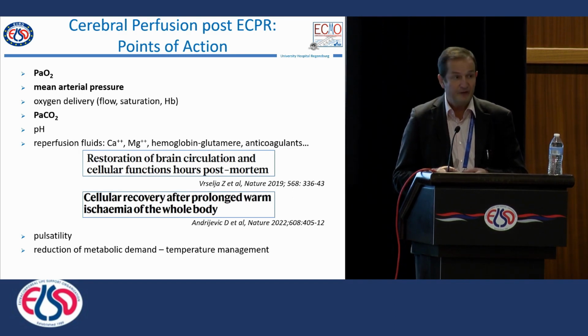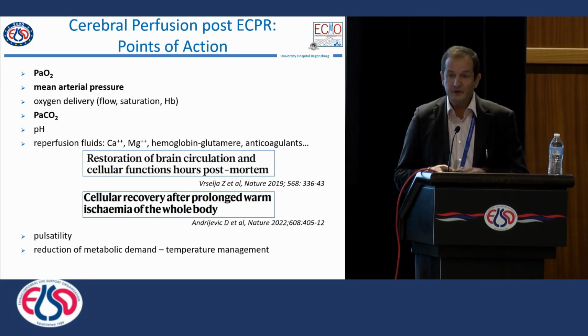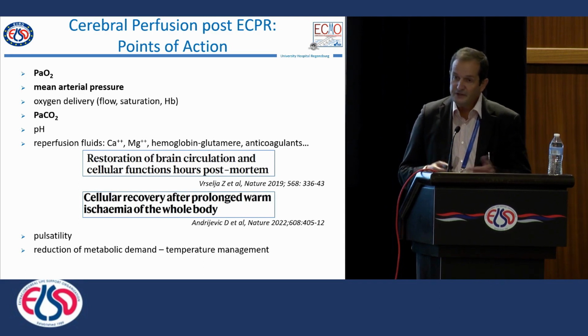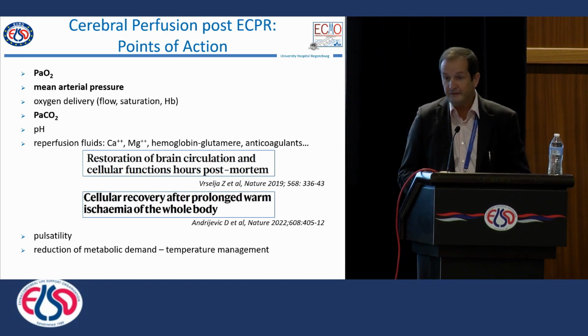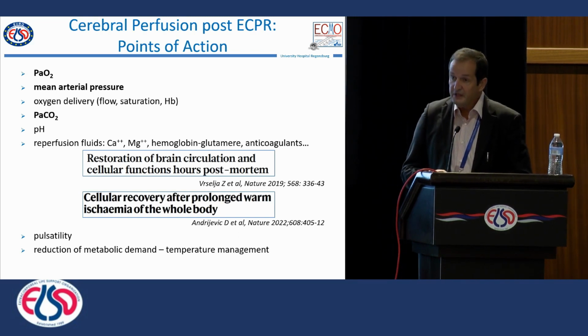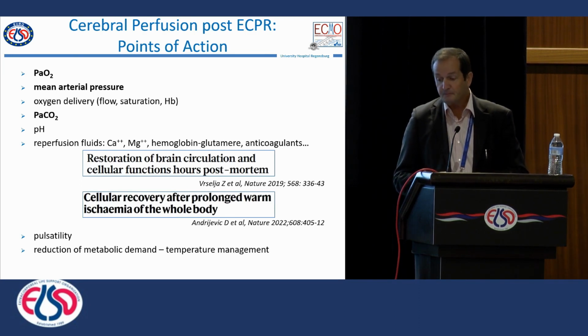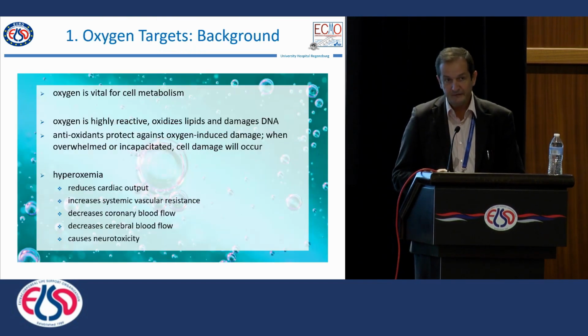Reperfusion fluids is a very interesting topic which I think we will talk about in 5 years' time. You are probably aware that in Nature there have been 2 interesting publications showing that with different reperfusion fluids you may be able to even revive organs and the brain in animals. There is the big question, could pulsatility improve outcome? Should we have devices which cause pulsatility? Question mark. And of course, we could also reduce the metabolic demand, for example, by cooling our patients. But let's talk about the first 3 in the coming few minutes.